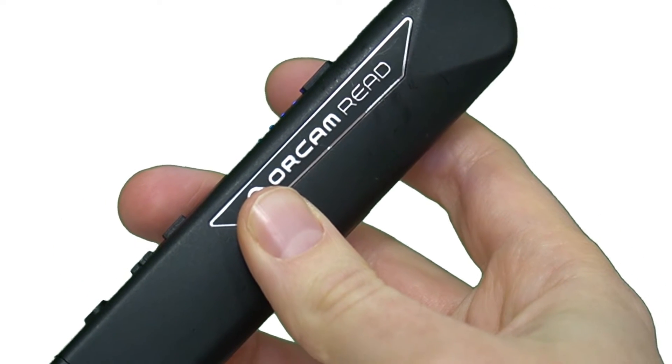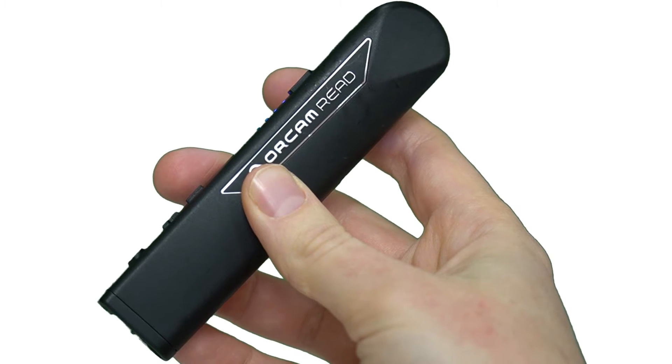This is a very nice device from OrCam, who you might be familiar with. They have a couple of devices on the market already, which are really cool — little optical character recognition devices that go on the side of glasses. But this particular one is designed to be handheld, and it is also designed to read aloud to you, and it does a fantastic job.